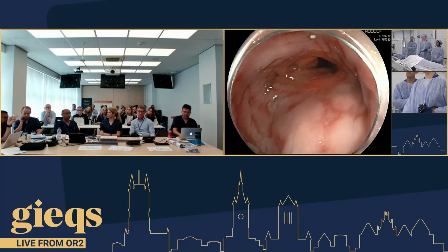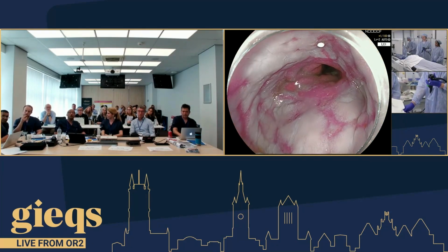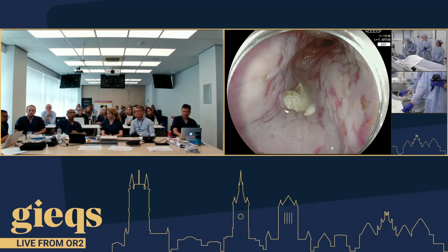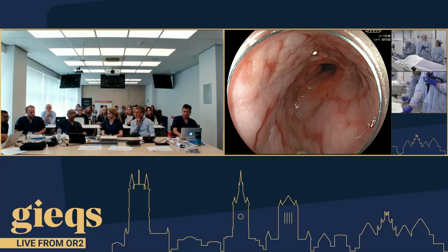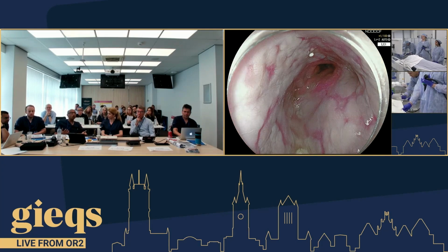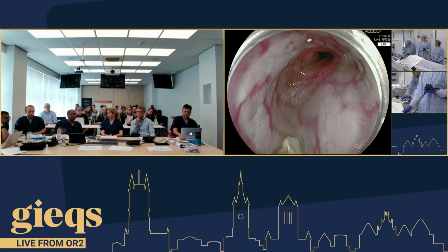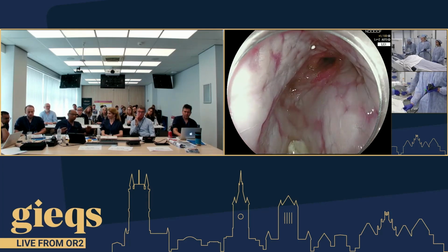And another question too. You're afraid to miss bleeding if you use adrenaline, that you will not coagulate those vessels. It's a very good point: if you use adrenaline that prevents immediate bleeding, will you get delayed bleeding because you missed it? If you're using adrenaline, as soon as you do resection, what we do is a water agitation of the base. So you use your water jet and fire water jet briskly on the resection base. If there is a vessel, it will start bleeding at you. Okay. So if your agitation test is negative, you don't need to worry.